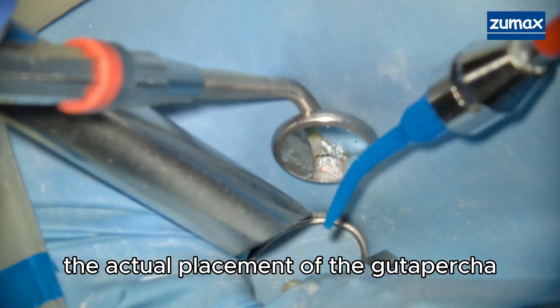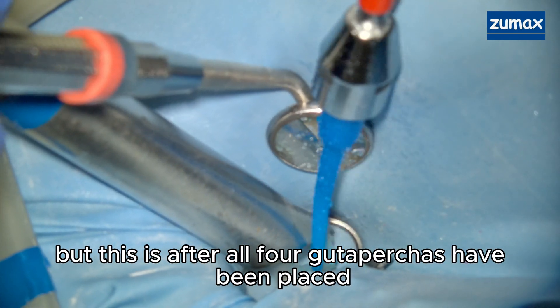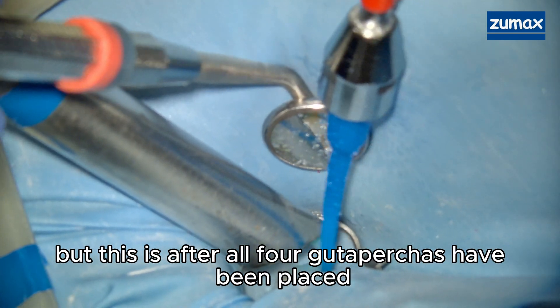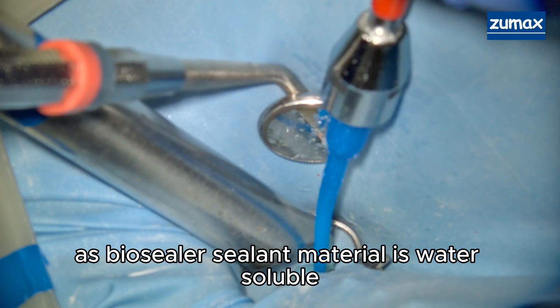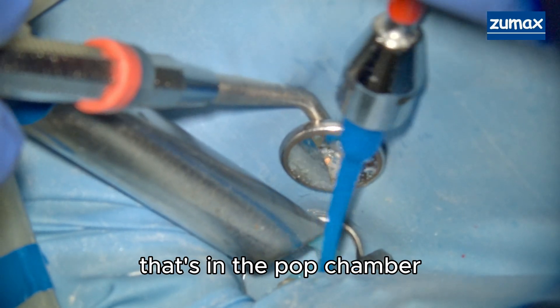I didn't get to film the actual placement of the gutta percha filling materials, but this is after all four gutta percha points have been placed. As bioceramic sealer material is water-soluble, I'm able to easily clean up the access cavity.